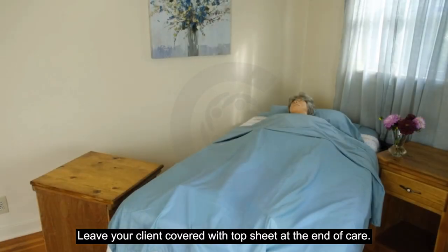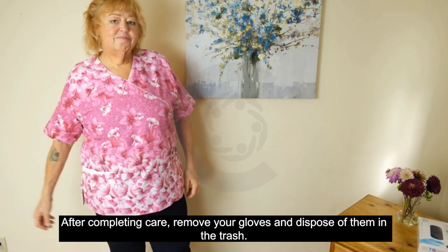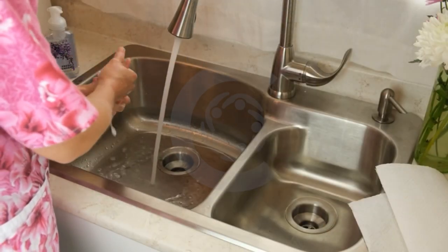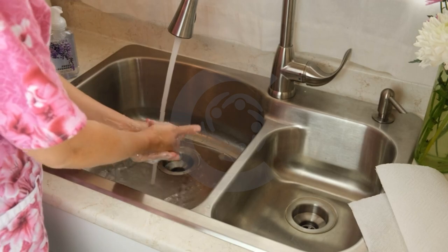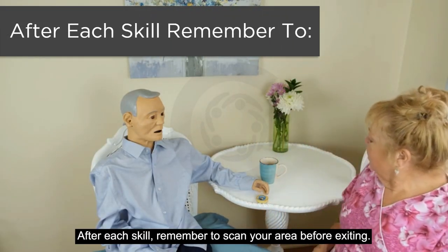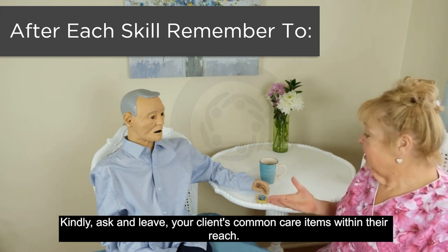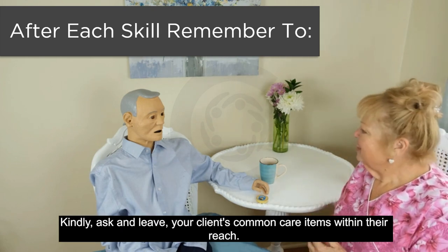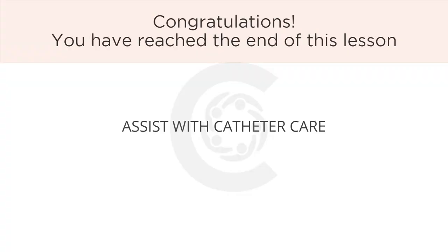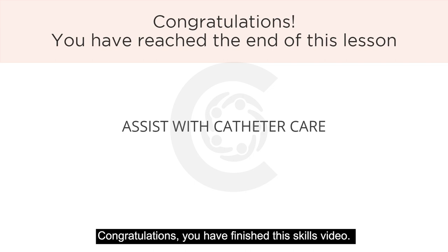Leave your client covered with the top sheet at the end of care. After completing care, remove your gloves and dispose of them in the trash, then wash your hands. After each skill, remember to scan your area before exiting. Kindly ask and leave your client's common care items within their reach. Congratulations, you have finished this skills video.